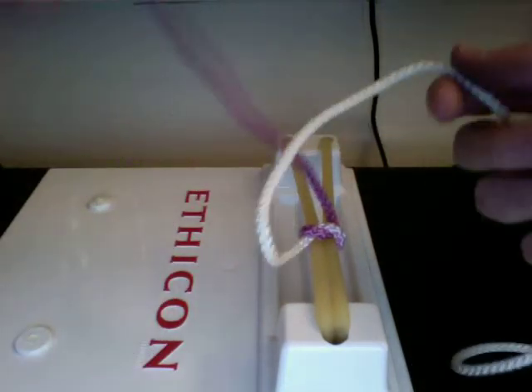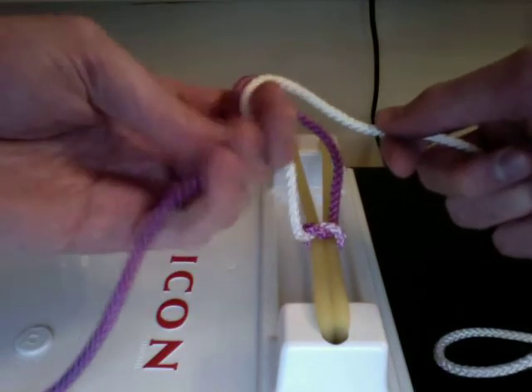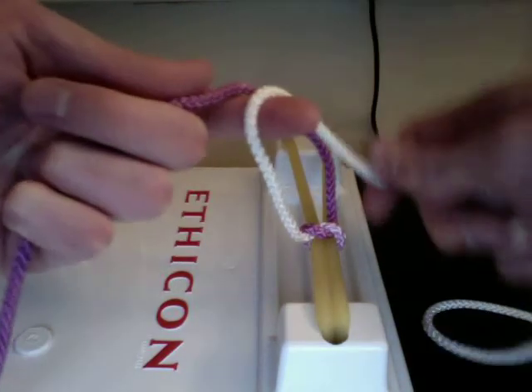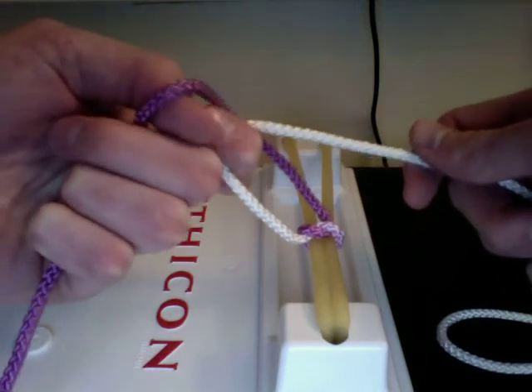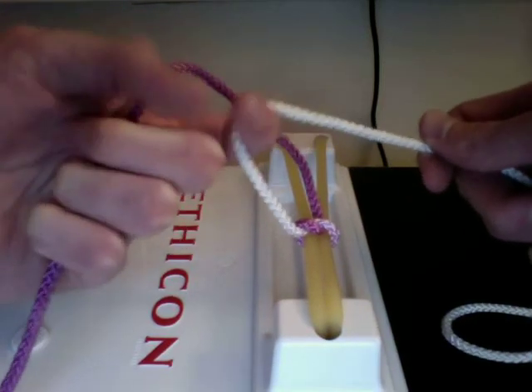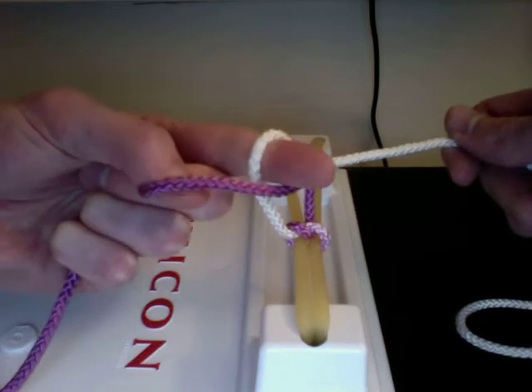Now you're going to use your first finger and put the white strand over the left finger in the opposite direction of the purple strand. The purple strand is now coming towards you, so the white has to go away from you. Curl your finger again and use your thumb to lift the purple strand over the back of your first finger — doing the exact same thing you did with your middle finger, pulling it over the white and under the purple, then straightening out your finger.